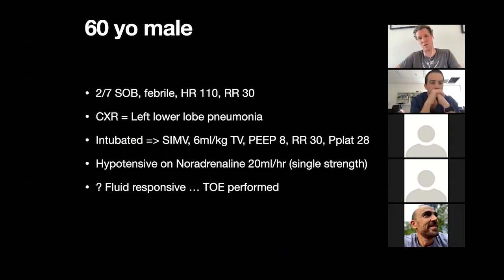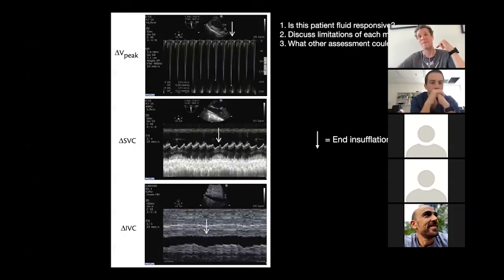And I very clearly didn't tell you what they are. I just said his heart rate's 110. So just make sure we're talking about those criteria being there before you can make these assessments.